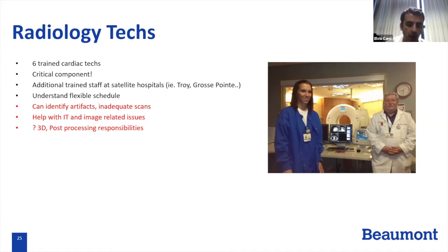And the techs are the ones that decide what protocol to use most of the time, unless they have a question. Then they call one of us, the readers. They're the ones that review the images and let the patient go, or if there's a significant artifact, then they will repeat the scan.